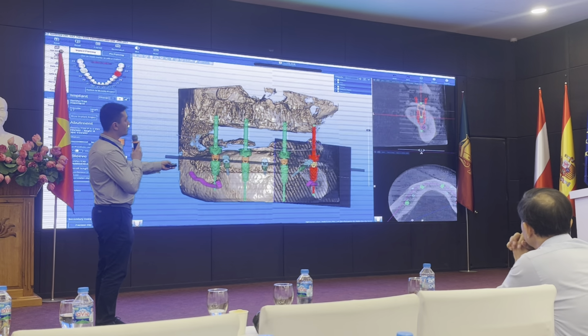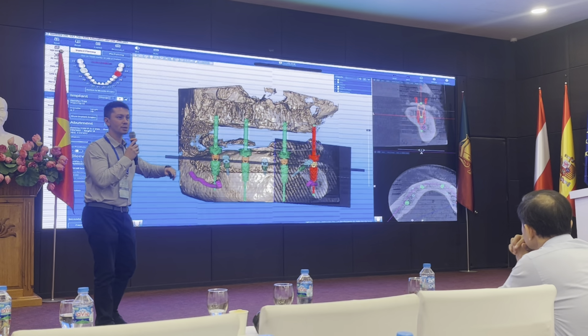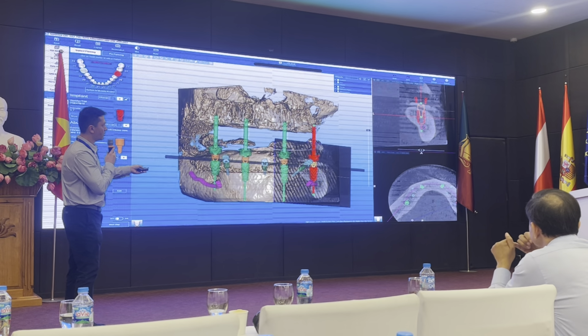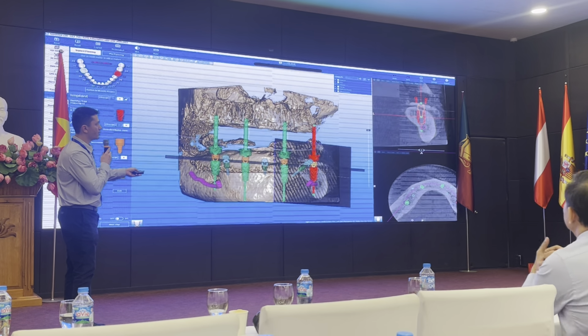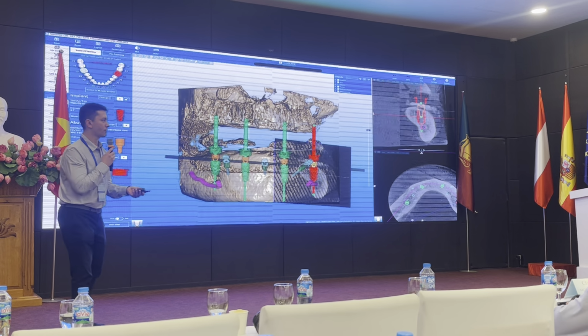One could be this implant is sunk deeper into the bone, subcrestal, by approximately 2 millimeters maybe on the lingual, and we're at the crestal level on the buccal, but we're also almost less than 2 millimeters away from the apex of the implant to the inferior alveolar nerve.